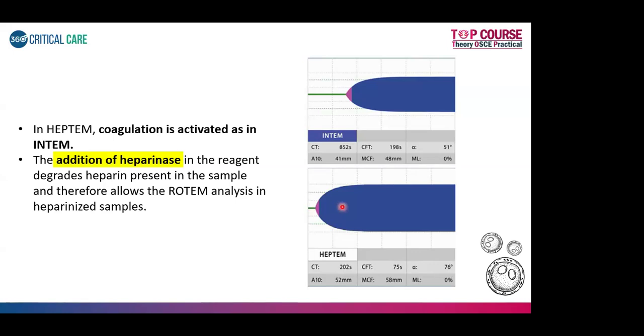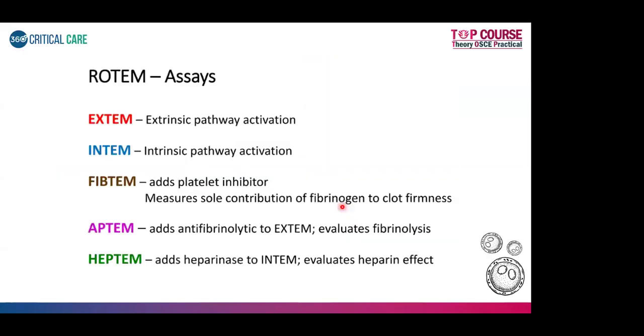These are the advantages compared to TEG. In TEG, you don't have anything related to primarily looking at fibrinogen, primarily looking at heparin, etc. Correct. So these things can be offset with the use of ROTEM.